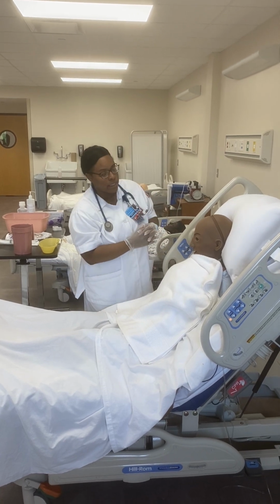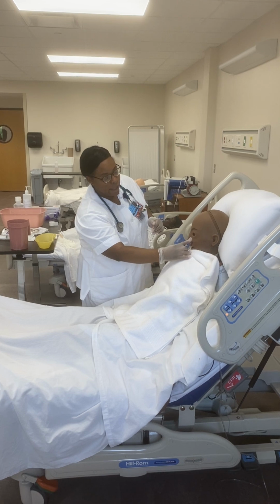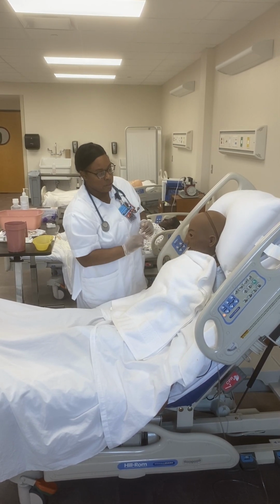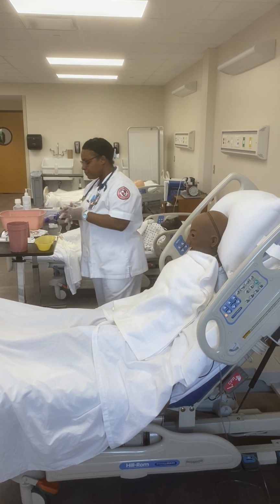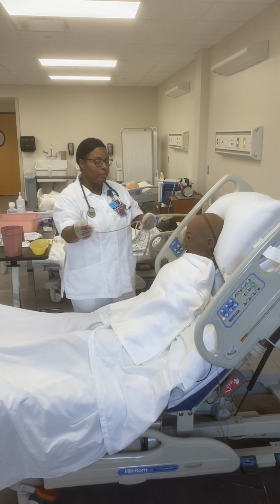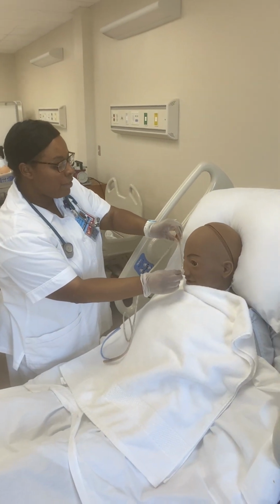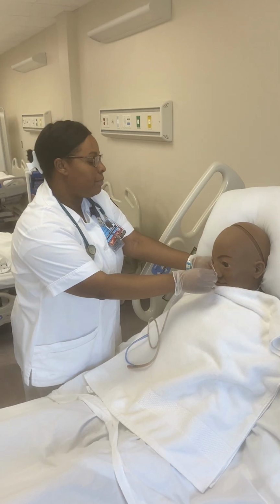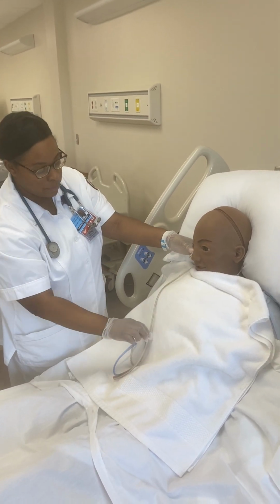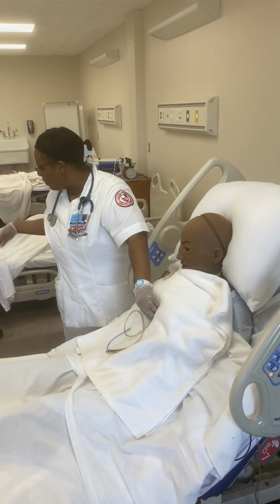Then I will assess the patency of the nostril by occluding one and asking them to breathe through the other one. After checking patency, I'm going to measure the tubing from the tip of the nostril to the tip of the earlobe, down to the tip of the xiphoid process, and mark with tape.